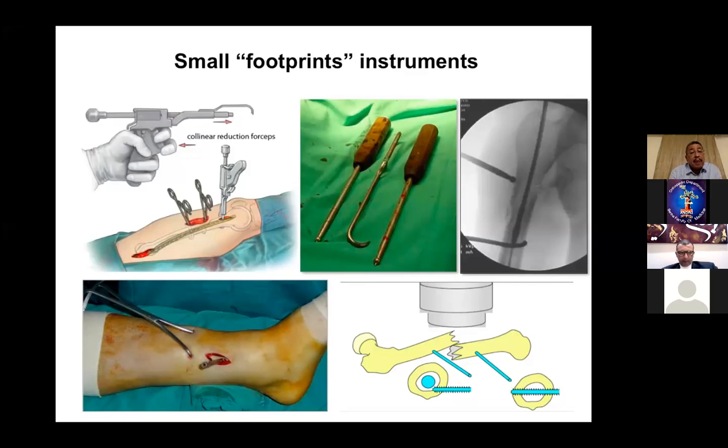During minimal invasive plating of the distal tibia, it helps to keep the reduction during the fixation of the plate. It can be used as well in intramedullary nailing of the tibia, because the tibia is subcutaneous. You can insert this pointed reduction clamp to keep an oblique fracture during introduction of the nail or the plate.